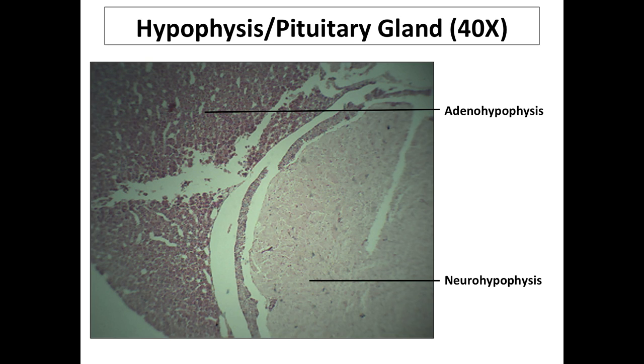We're going to go through the endocrine histology that you'll cover in lab. To begin with, you'll look at a cross-section of the pituitary glands. Now, of course, there's an anterior and a posterior pituitary, but we prefer for you to identify them as the adenohypophysis, seen here, which is the anterior pituitary gland, and the neurohypophysis, seen here, which is the posterior pituitary.